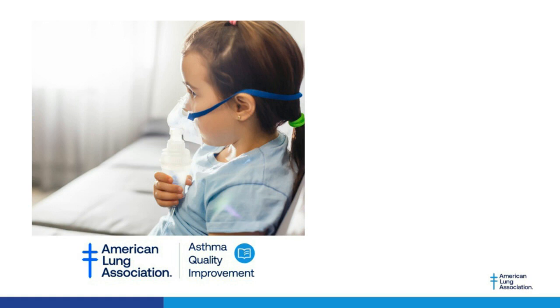Now, most of those little handheld screening spirometers are basically just a little bit of a complex peak flow meter that also does FEV1s. Most of those are turbine type devices. And I do not know of a way to put a filter on a turbine device. We couldn't put it in the front or in the back of it because it would change all the numbers. If you put an exit filter on a turbine type device, the turbine would spin slower. And same thing if I put a filter device on the front of them. And so those devices I would not use to do spirometry unless they're single patient use only.